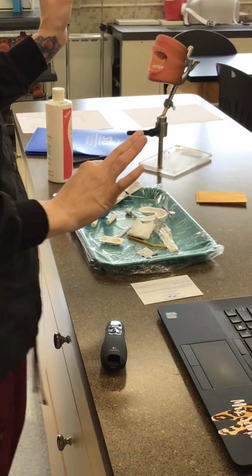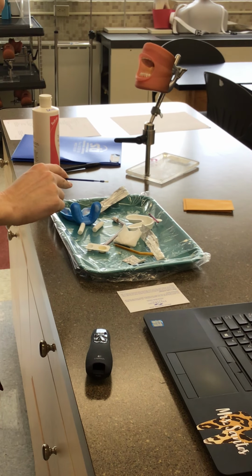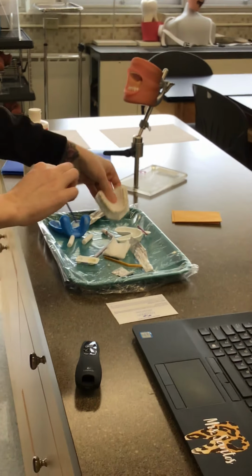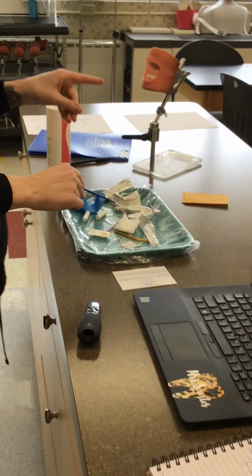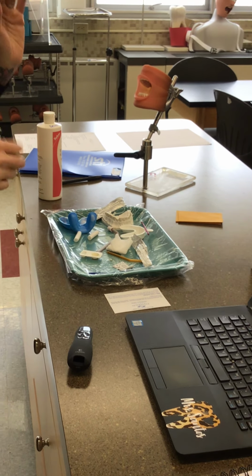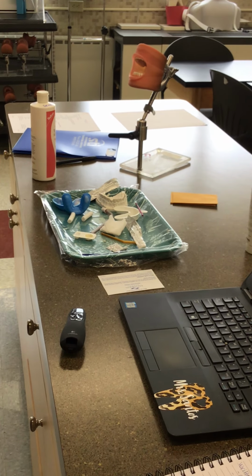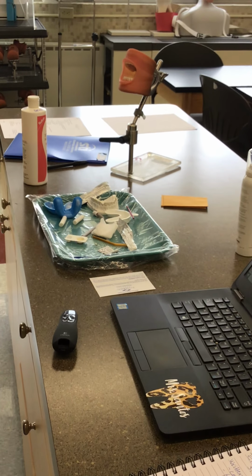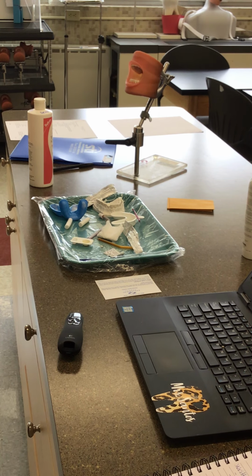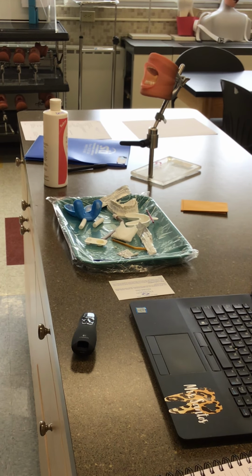So, what are our post-operative instructions for the varnish? 30 minutes. No, 4 to 6 hours. Yep, so we don't wanna eat anything crunchy or hard for 4 to 6 hours, okay? Sticky, ultimately, yes, is one of them too. You don't wanna pull that off. You don't wanna have any hot or alcoholic beverages for 4 to 6 hours. And then you don't wanna brush for 4 to 6 hours or overnight, okay? So that's where they vary.